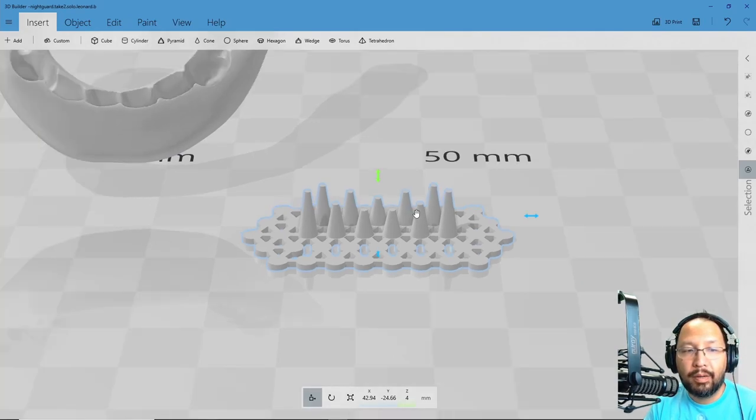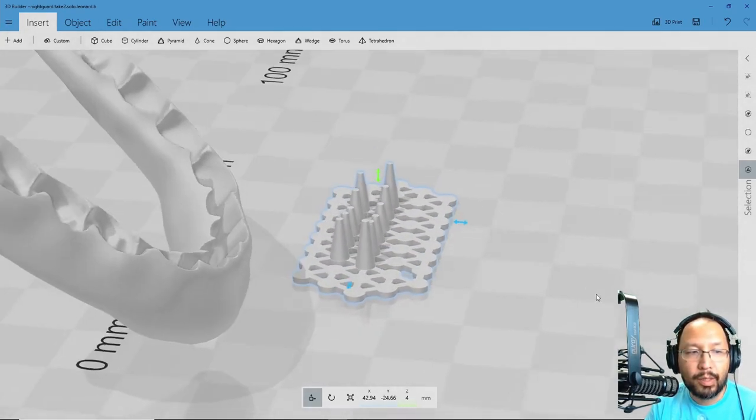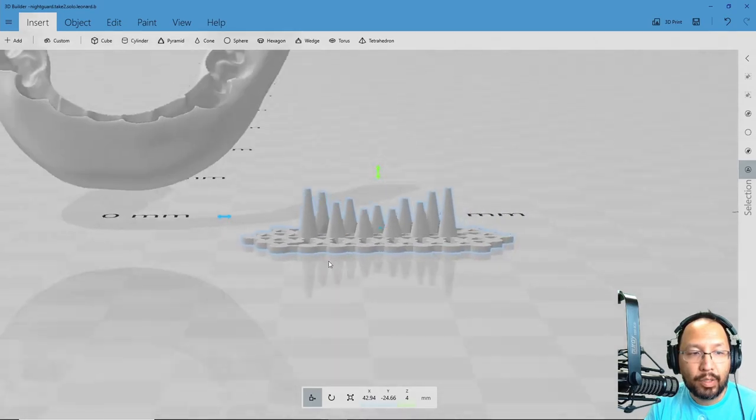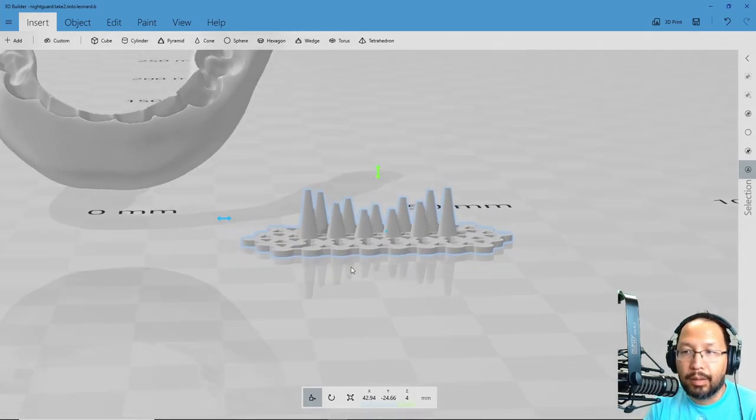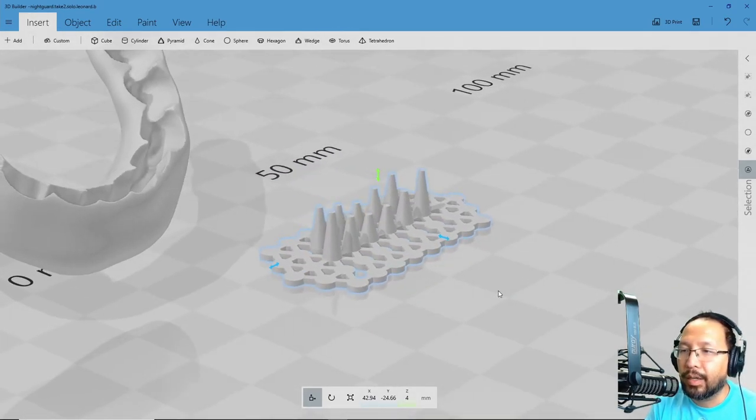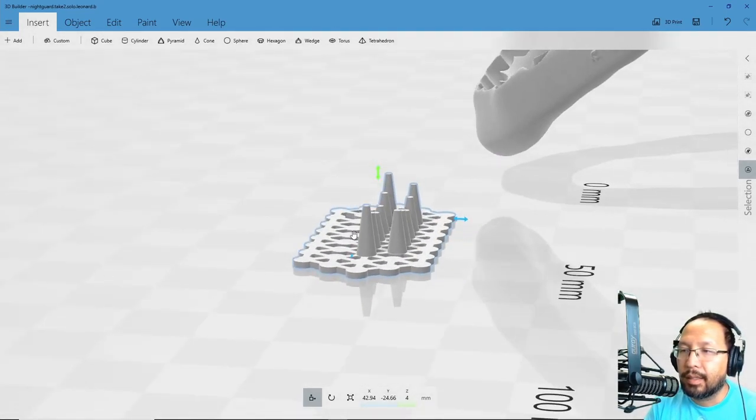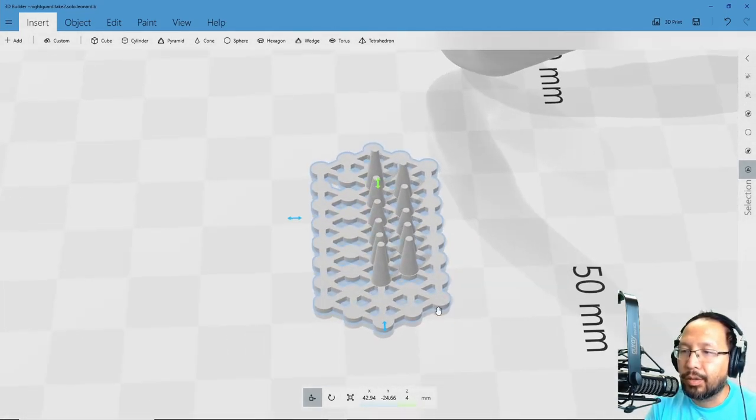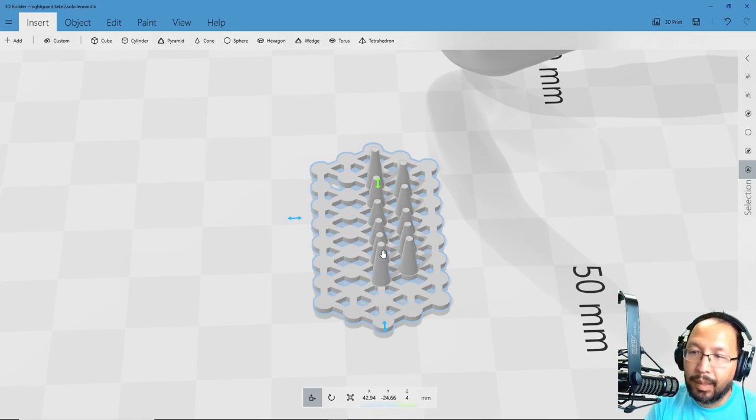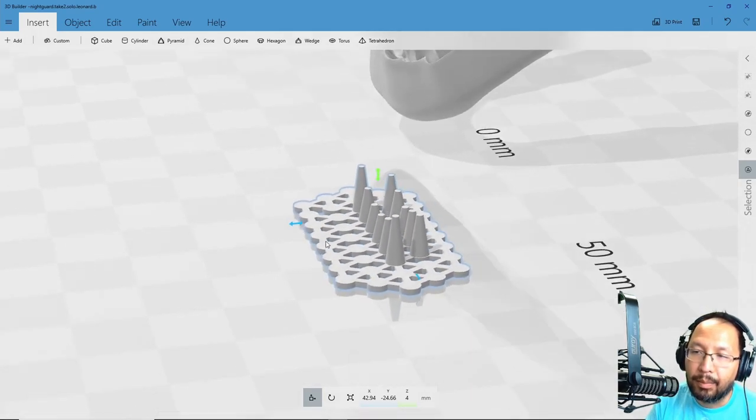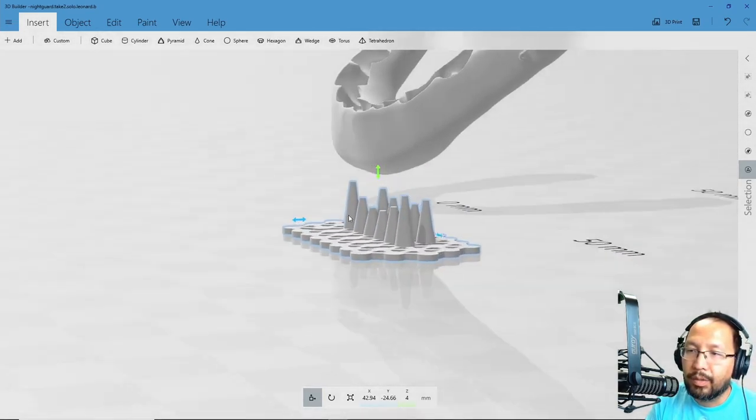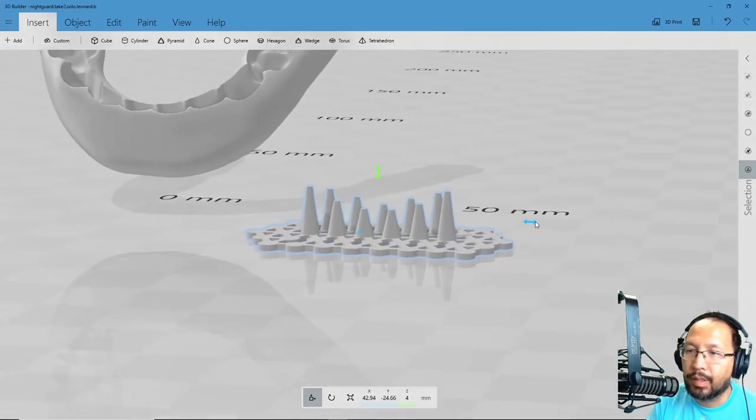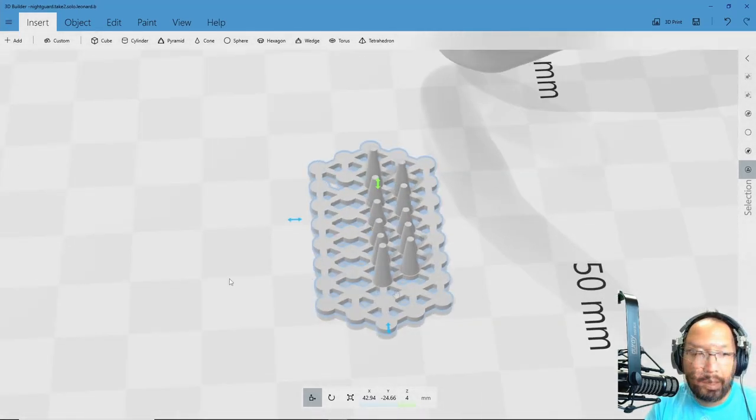Version 5 has two rows of support spikes here. They kind of look like Crayola crayon tips, if anything. And these support spikes are designed to be extra thick. They are about three millimeters in diameter at the bottom, and they are about one and a half at the top. And so that gives you a nice, fat surface area to contact with.